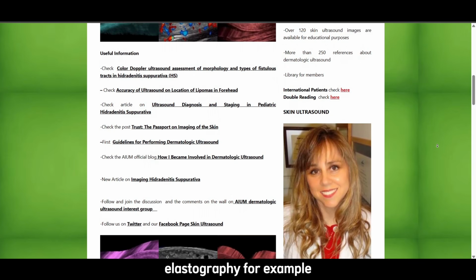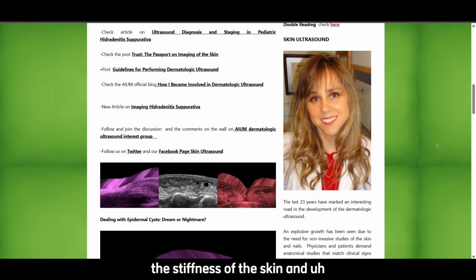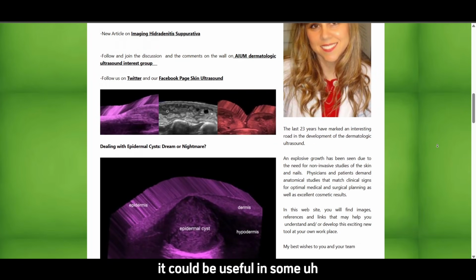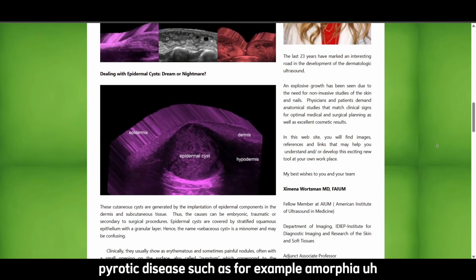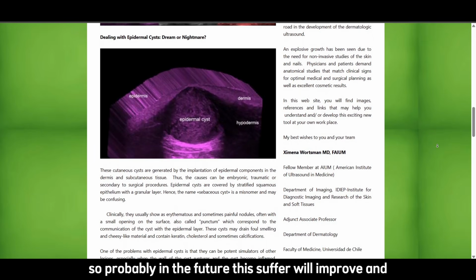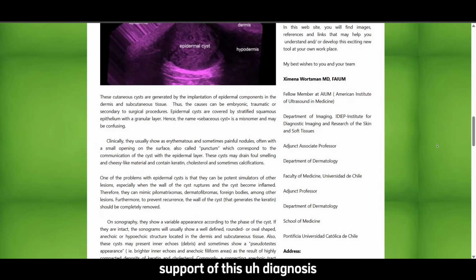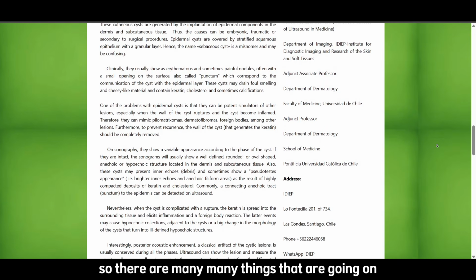Another point of development is the elastography. For example, elastography is a software that can measure the stiffness of the skin, and it could be useful in some fibrotic disease, such as, for example, morphea. So probably in the future, this software will improve, and we will have a better support of these diagnoses. So there are many, many things that are going on.